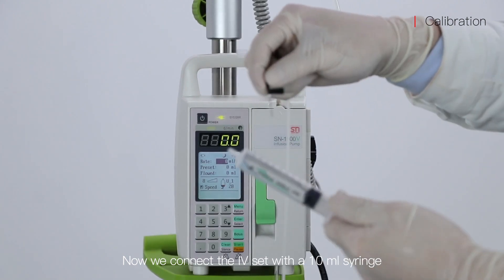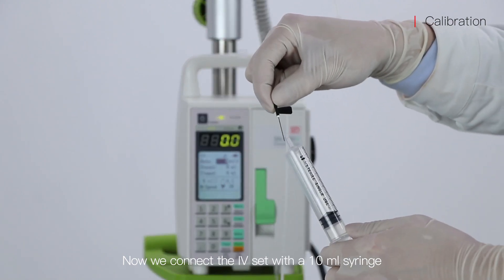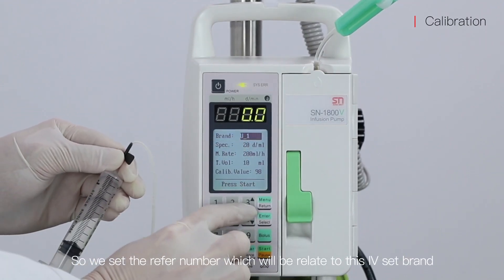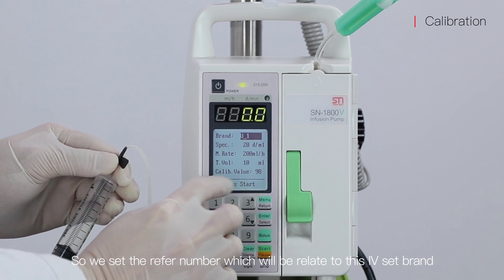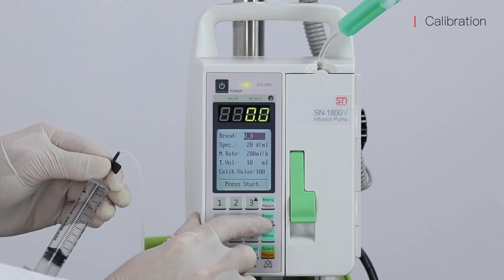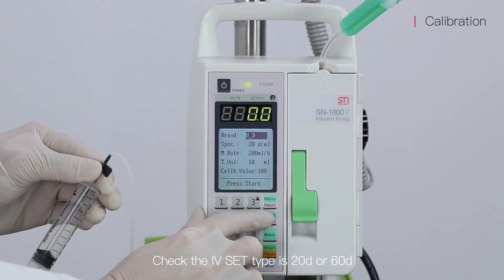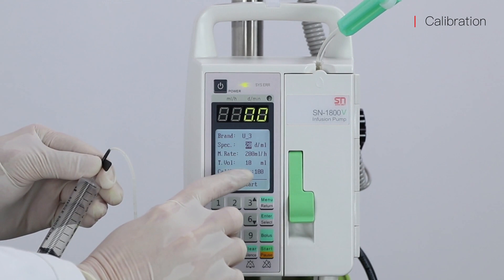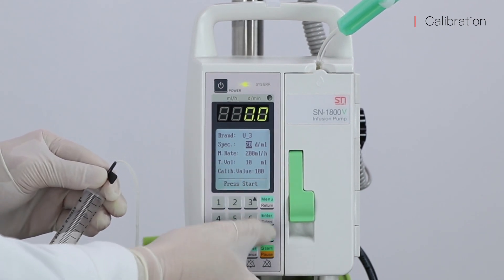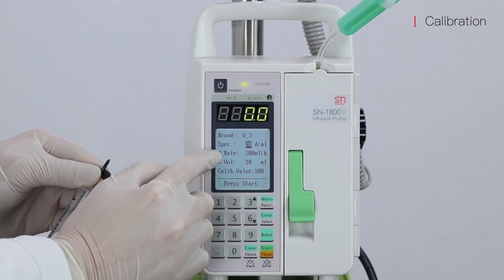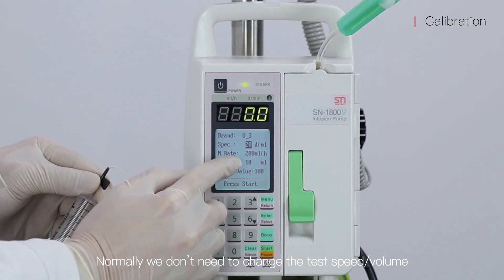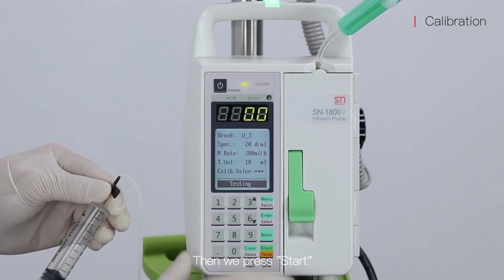Now we connect the IV set with a 10ml syringe. We set the reference number which will be related to this IV set brand. For example, we set U3. Check the IV set type is 20 drip or 60 drip. Normally we don't need to change the test speed and test volume. Then we press start.